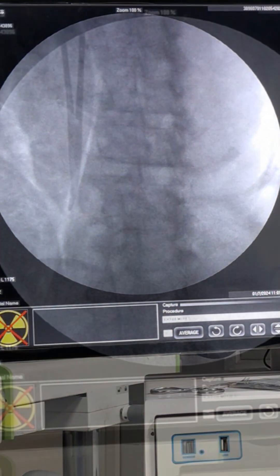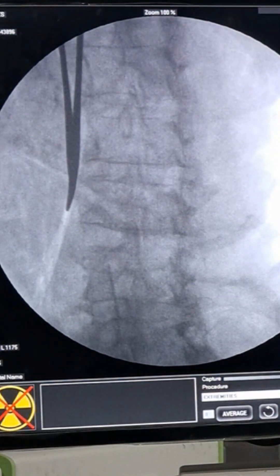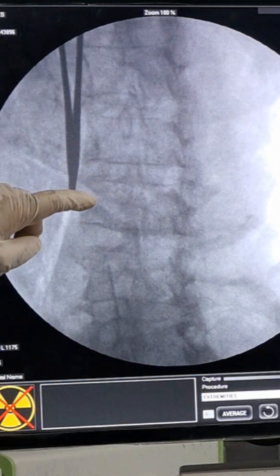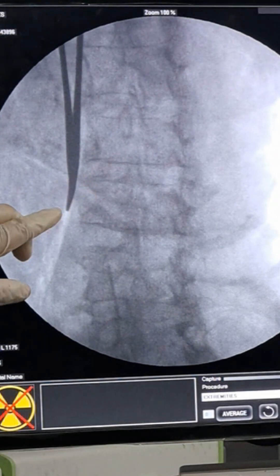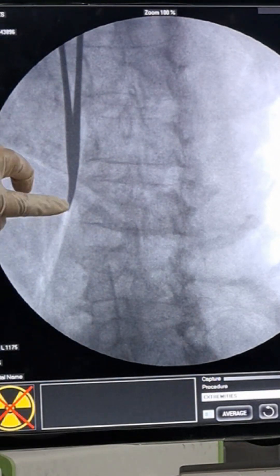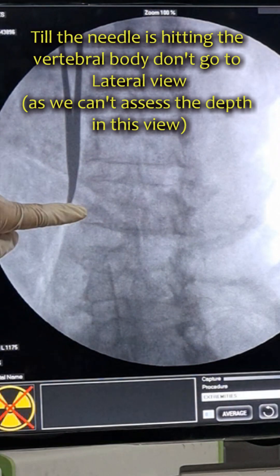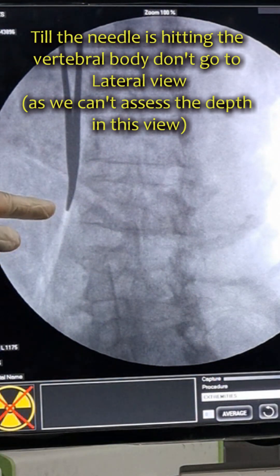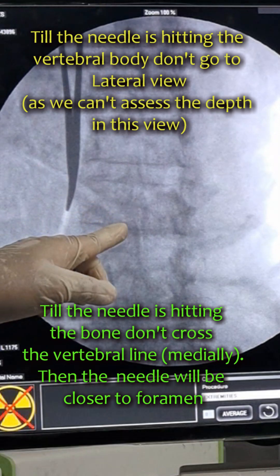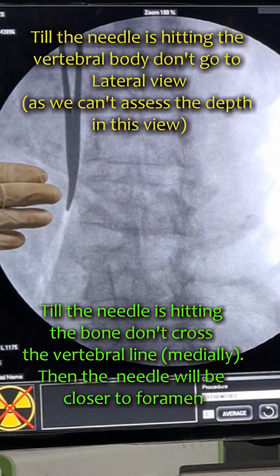I have taken the entry point approximately one centimeter lateral to the lower one-third of the vertebral body. Now I will advance the needle medially to hit the outer border of the vertebral body. Until I am hitting this outer border, I will not go to lateral view. I must ensure the needle does not cross the vertebral body line before actually touching the bone.